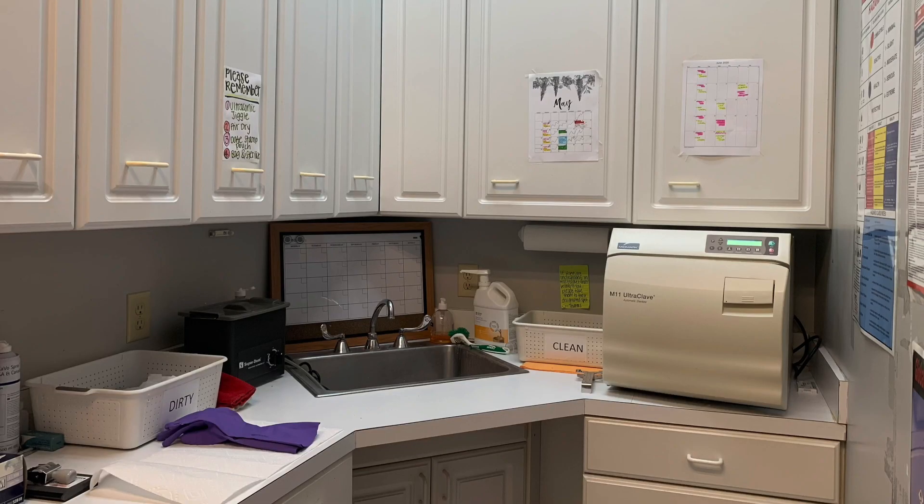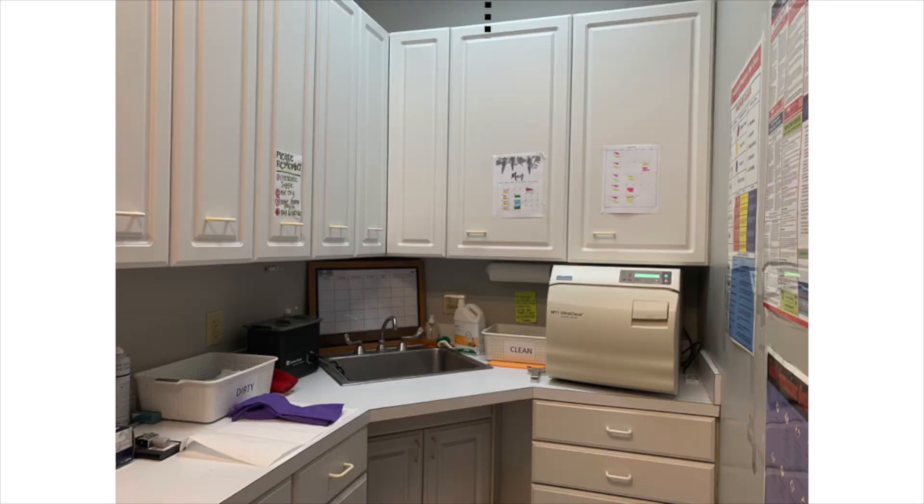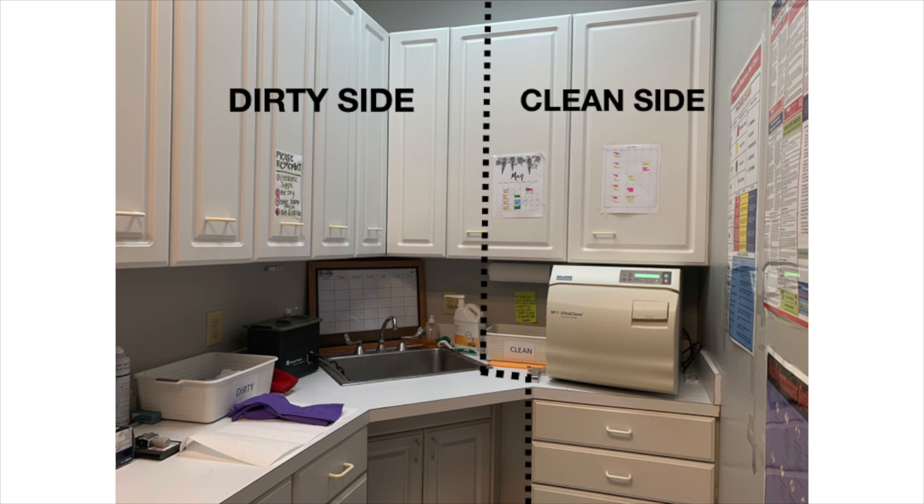Before starting, let's have a look at the sterilization area. This area is pretty tiny, but even then we need to have a clean side separated from the dirty side to avoid cross-contamination. Make sure your layout suffices that.